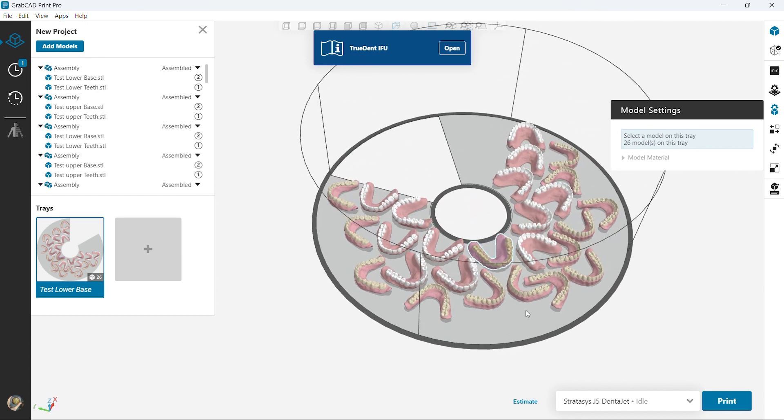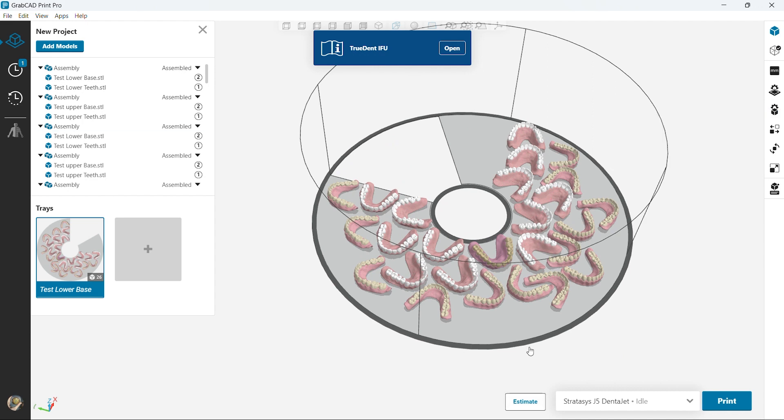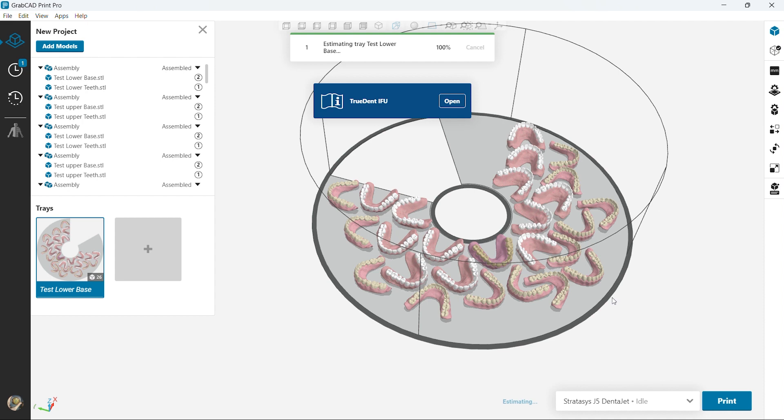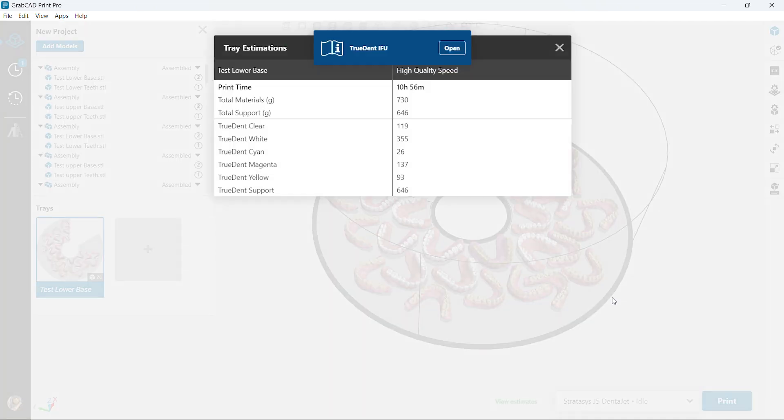So right now we're gonna estimate it, see how long software says this will take. Okay so right now if we look the total print time is gonna be 10 hours 56 minutes. It's gonna use about 730 grams of material and support.